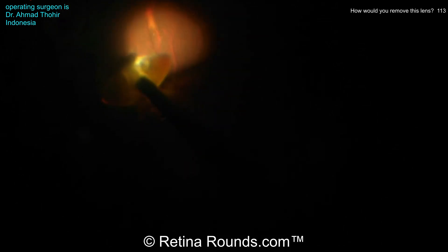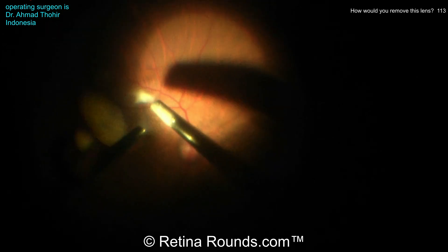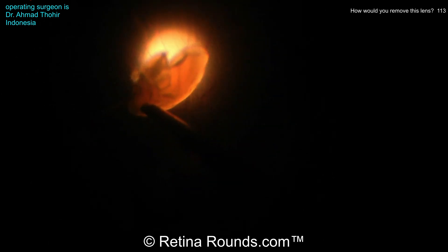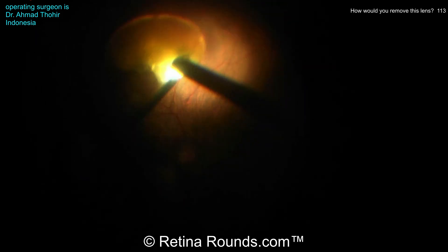As an alternative, you can just engage the ultrasound power with the frag and allow that lens to tumble into the frag probe. Dr. Tohir is engaging the ultrasound on the frag probe and allowing that lens to fall in, using the light pipe just to guide and support the lens so it doesn't fall back. This is something that happens very frequently with phaco fragmentation where the lens just falls to the posterior pole, which raises the issue of whether something needs to be placed on the posterior pole to protect the macula. For dense lens material, sharp edges can potentially cause damage to the retina, so some surgeons like to use a little PFCL over the posterior pole or even some dispersive viscoelastic as a cushion or barrier to prevent falling lens material from damaging the macula.